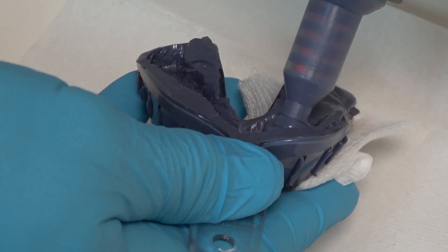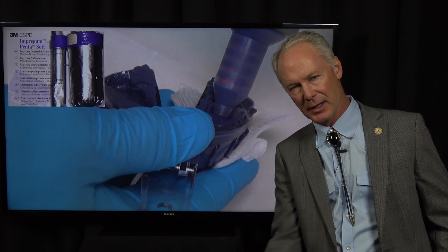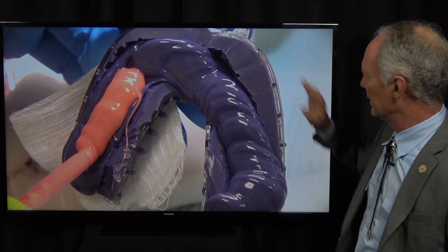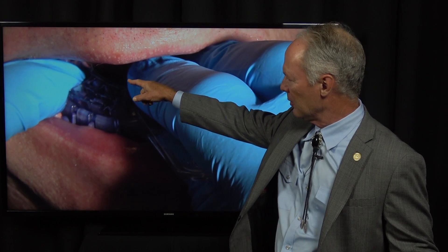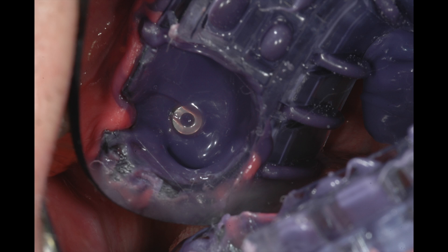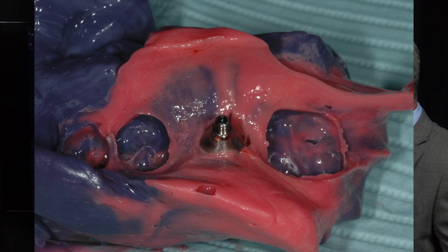We're trying in the tray — you can see the impression coping sticking through the hole. Now I'm flowing polyether into this custom tray. Notice I've got a 2x2 over the hole in the custom tray to keep that polyether from flowing out. Then I'm squirting the wash material around the impression coping and onto the unset polyether in the custom tray. Now I remove the 2x2, push the impression into place, and take my finger in that hole and push it down until I feel the coronal part of the impression coping. Once I feel that, I leave it there until the initial set, then I remove my finger. I've removed the impression material that was in there and unscrewed it, so the impression pulls right out — there's the impression coping, it comes out in the tray.